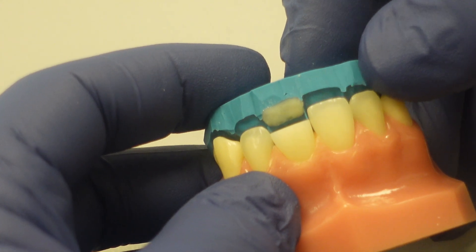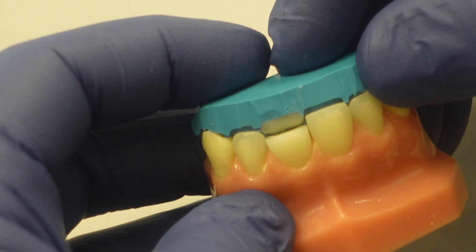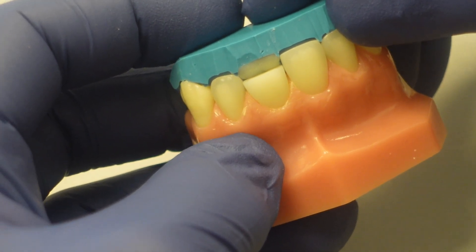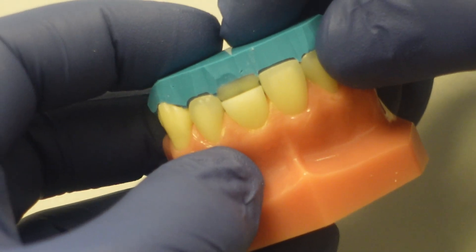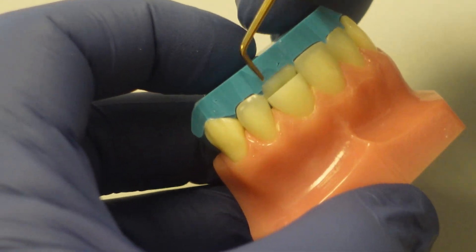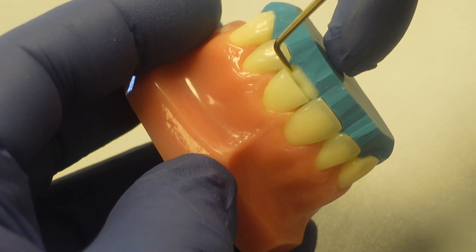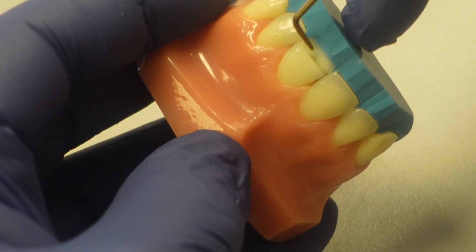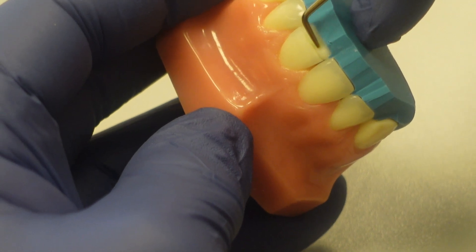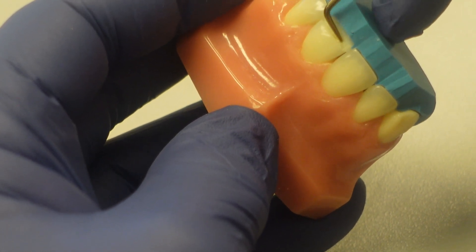So when I'm seating this, what I want to do is watch on the lingual margin. As I seat it, I can see it touch the lingual margin. If I can tell I'm a little short, then I can lift it back up a little bit before I seat it all the way. And then once I get it in position, I want to get rid of that cleavage — what I call this little valley in there — and blend that into the tooth structure.